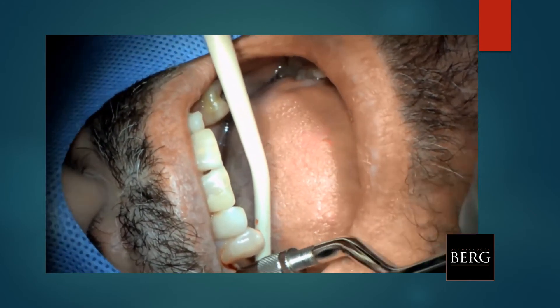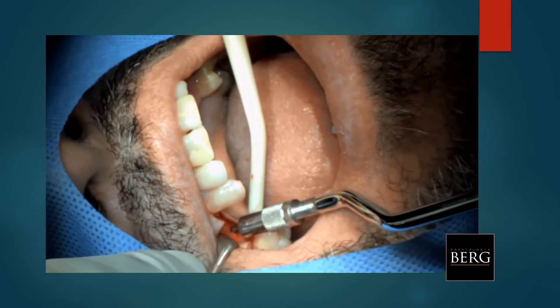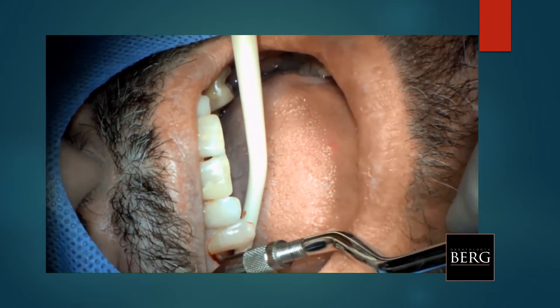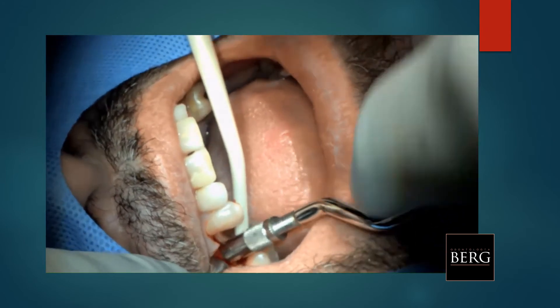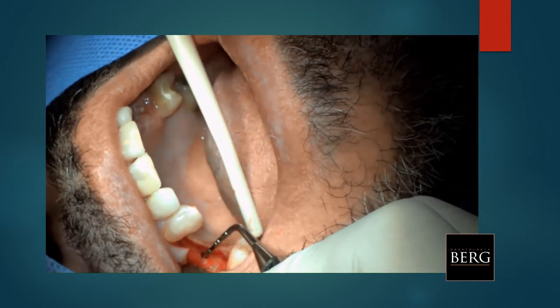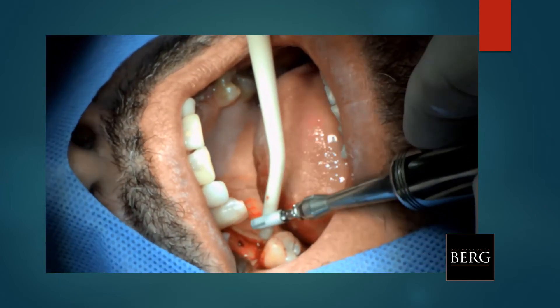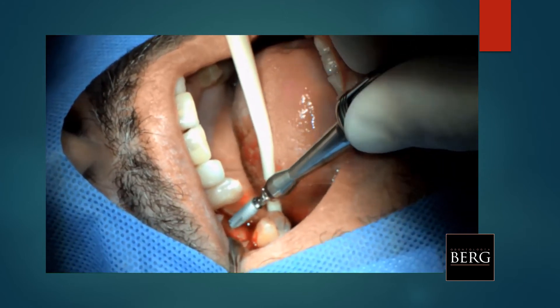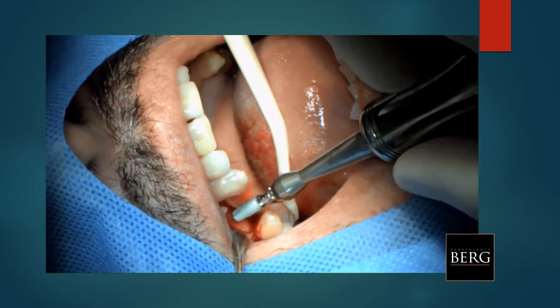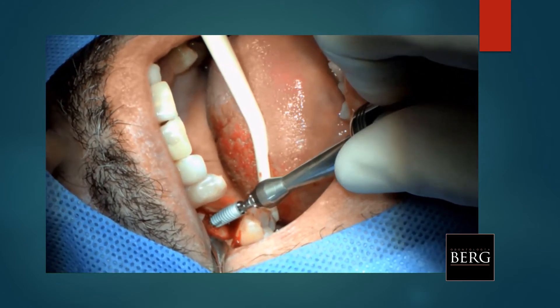We just applied direct pressure. Very slight tapping. We complete our initial bone disc formation and slight displacement of it towards the sinus. As you can see, we're half the way of the first marking, which is six millimeters. This is a DIVA implant, 3.75 by 13. We could have placed an 11.5, but this was a case for doing this.